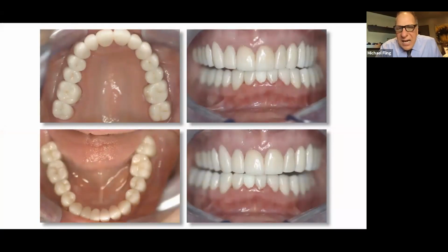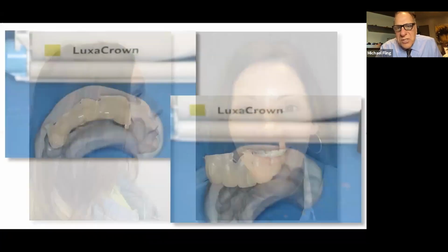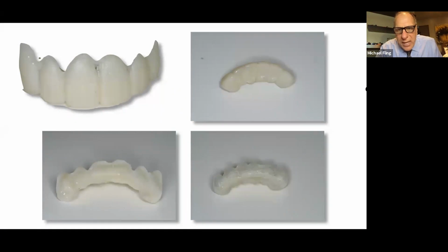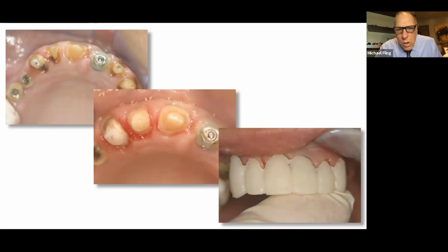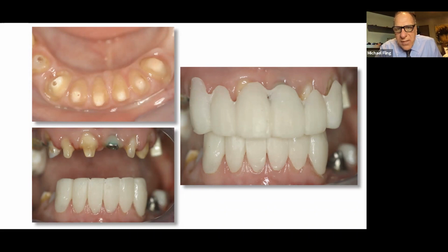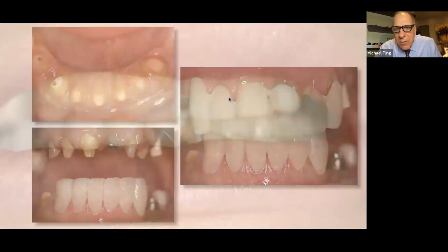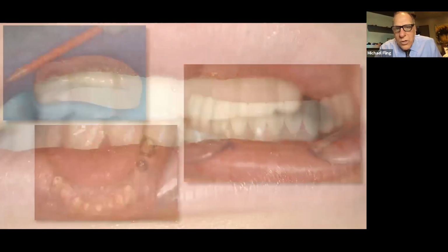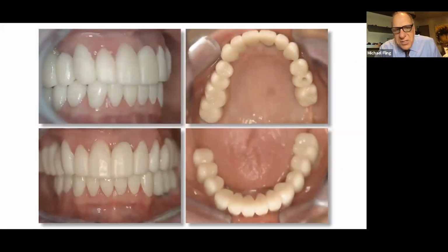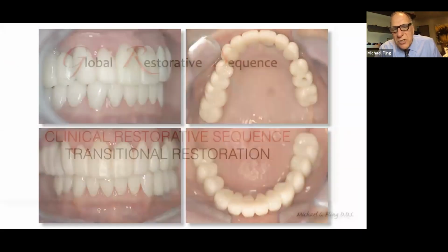So keeping all of that in mind, as we go forward, this was a case where I'd actually used the same technique with Luxa Crown, but we did change vertical dimension on her. Here you see the shell, right? So we're gonna fill it full of more Luxa Crown to seat these shells. So here they are where I'm passively getting them to fit before I reline them. And then we'll use that same technique to get her coupled, clean up the margins, more or less the same thing we just discussed. So then we can transition that.